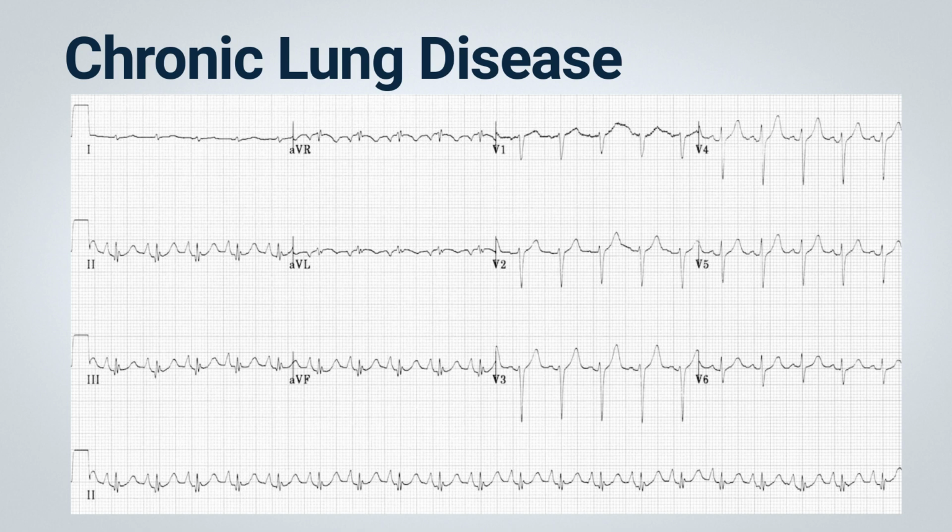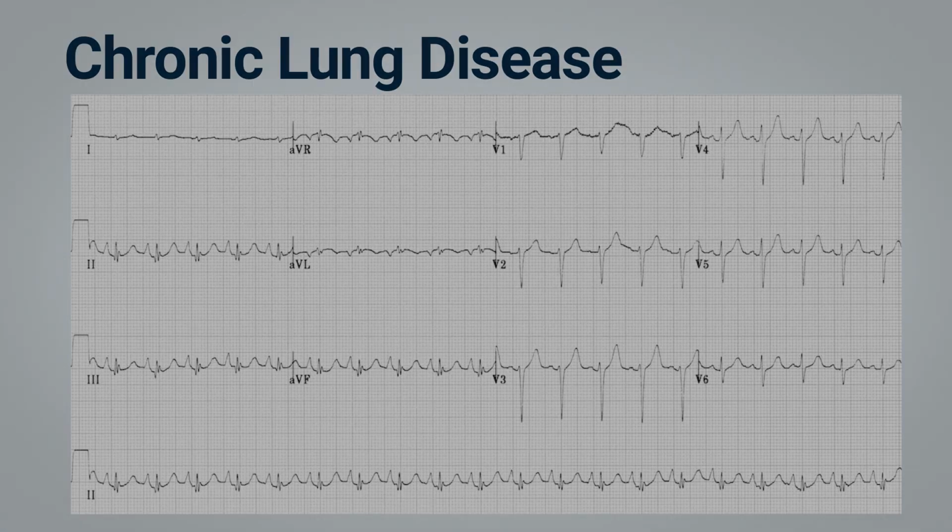Due to emphysema, the heart often assumes a vertically oriented position in the chest, which may, along with possible right ventricular enlargement, result in a vertical or rightward, plus 100 degrees or greater, QRS axis. Moreover, the presence of tall, relatively narrow P waves is indicative of right atrial overload and is accompanied by a vertical or rightward P wave axis, approximately plus 90 degrees.